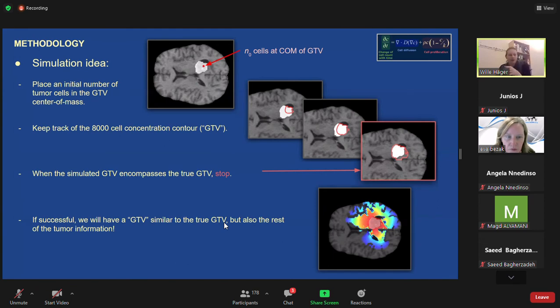in that we have like a homogeneous dose distribution in the CTV. We'd have to, of course, account for that, because these are vastly different cell concentrations close to the tumor and far away. So I think I will give this tool to the oncologist, and I will let them do whatever they want with it, as they see fit best.